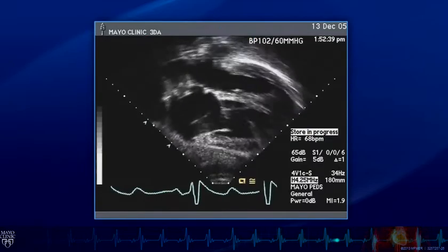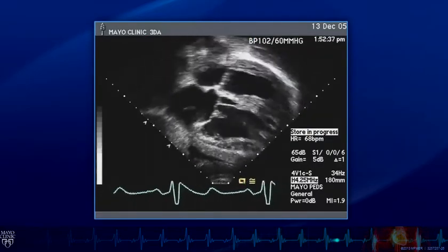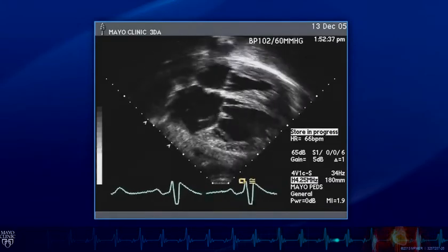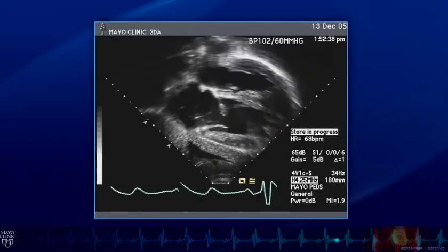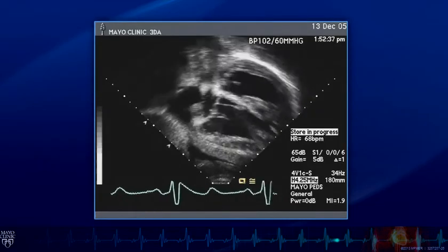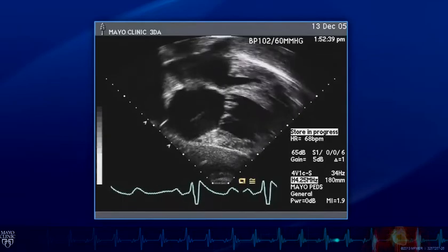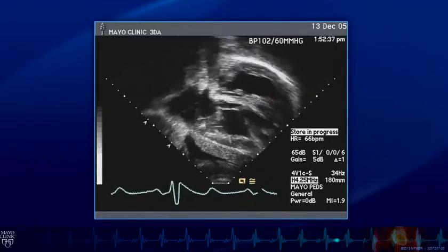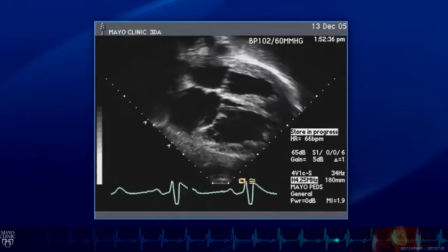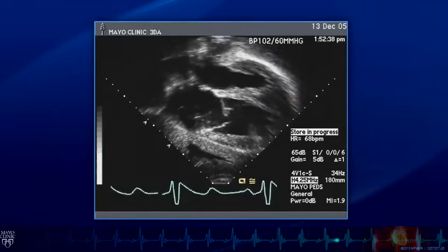These are most commonly diagnosed on transesophageal echocardiogram, but here's a nice example on transthoracic echo showing that with good subcostal pictures we can diagnose these defects in the adult. This is an adult patient who presented with pulmonary hypertension for evaluation. In this subcostal image, we see that there is significant right atrial and right ventricular enlargement with right ventricular hypertrophy.